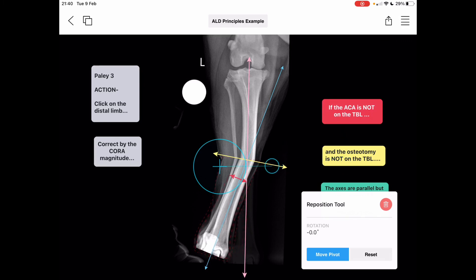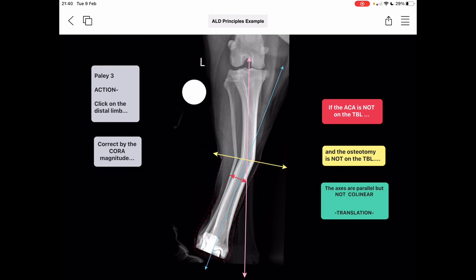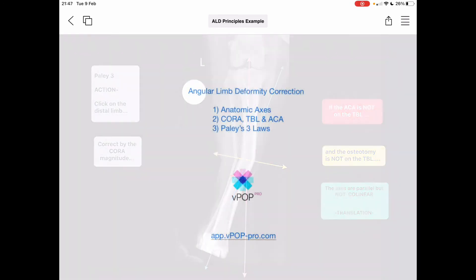That's Paley's third law of osteotomies demonstrated in VPOP Pro. To complete this video: we have illustrated and defined anatomic axes, defined a CORA — the centre of rotation of the angulation — shown how to delineate and explained the significance of the transverse bisecting line, a line that joins any two CORAs, illustrated the angulation correction axis and the significance of where it can be sited, and finally illustrated Paley's three osteotomy laws using all of the above terms, all in VPOP Pro.